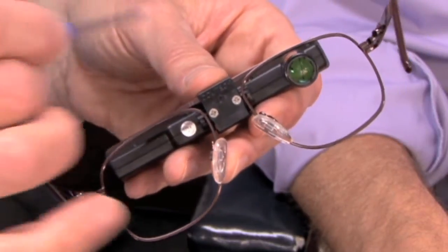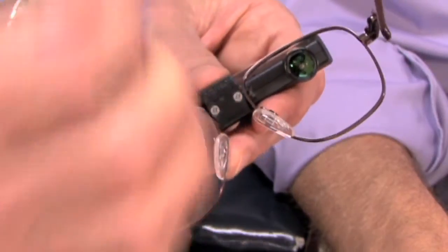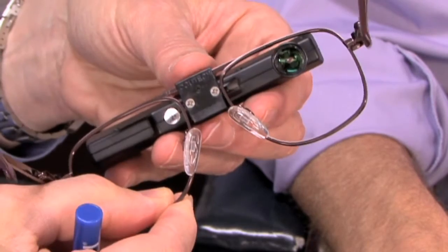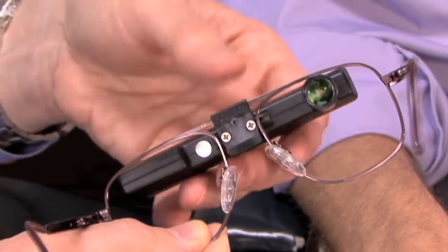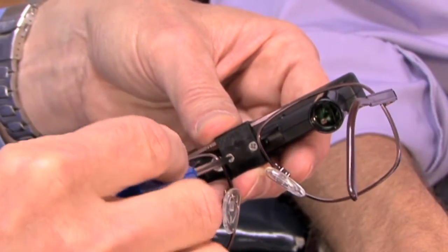The first step in fitting the telescope is to loosen the two set screws on the back of the frame. This allows us to move the telescope right to left to line it up for the pupillary distance and to change the angle of inclination. You want it loose enough to move it, but not so loose that it won't stay in place.